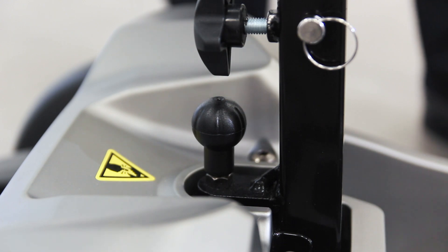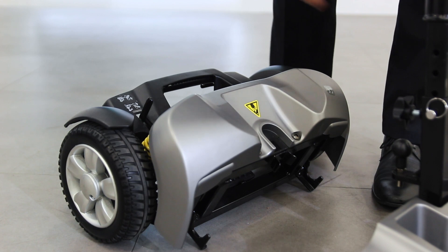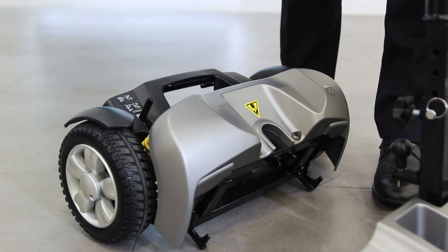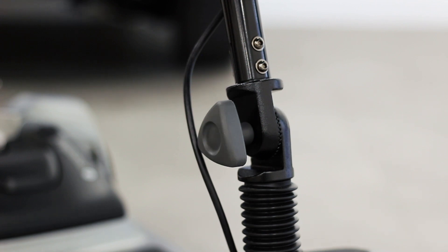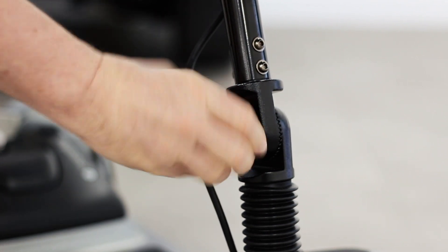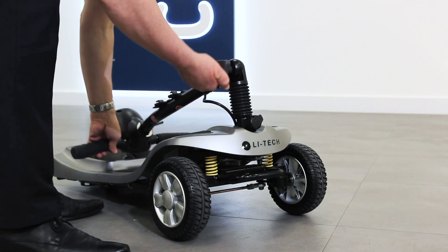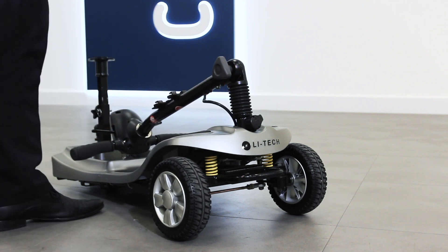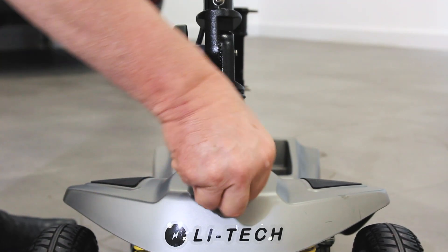Lift the lever located behind the seat post, then lift the front section by the seat post to split away the two halves. Lift out the front basket, then turn the knob to lower the tiller bar. Ensure the tiller is locked before lifting so the tiller doesn't swing away. You can ensure the tiller is locked into place by checking the teeth are lined up and pulling and rotating this button.